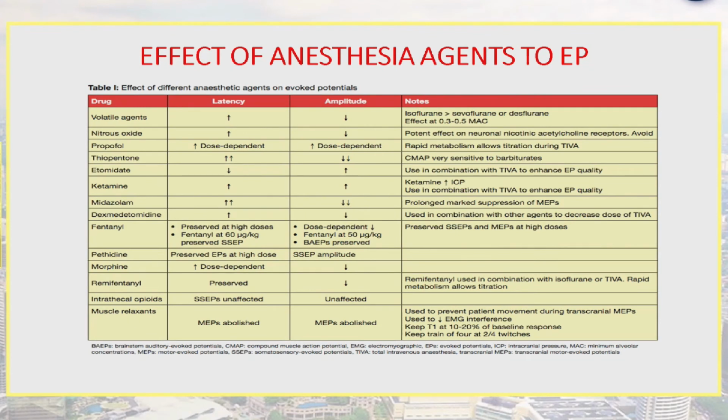Okay, so we go to the effect of anesthesia agents on evoked potentials. Volatile agents will definitely increase latency and reduce amplitude. The effect is usually seen at 0.3 to 0.5. Usually we advise for SSEP to try to use less than 0.5. Right? And isoflurane is worse than sevoflurane and desflurane. Nitrous oxide is a bit controversial, but try to avoid it. Propofol's effect is dose dependent.